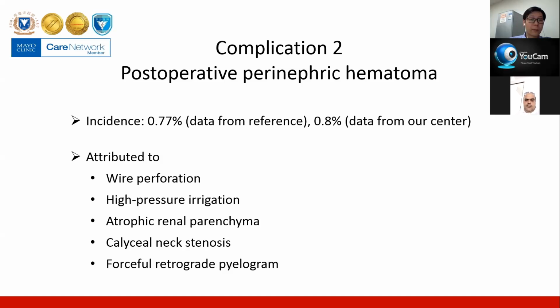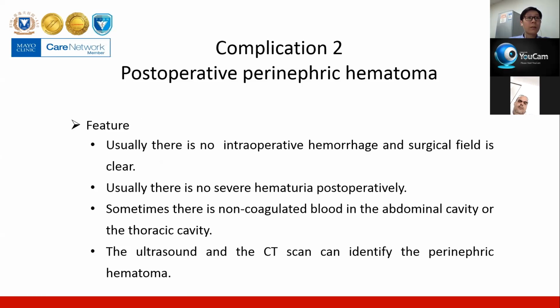Occasionally, the post-operative perinephric hematoma is also caused by the forced retrograde pyelogram. And the post-operative perinephric hematoma also has its own features. Understanding these features will help us to recognize this complication as early as possible.